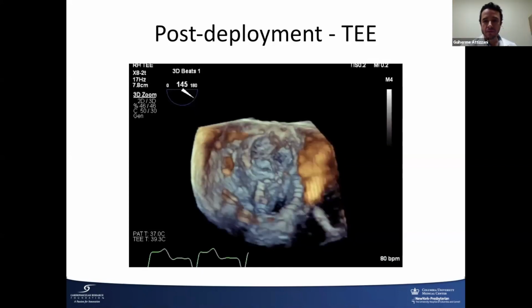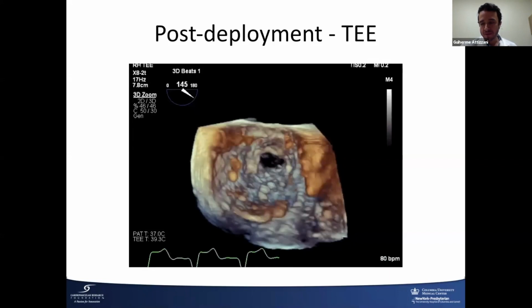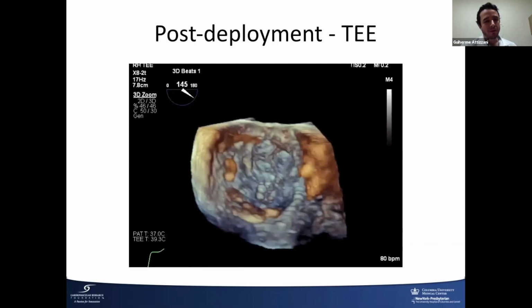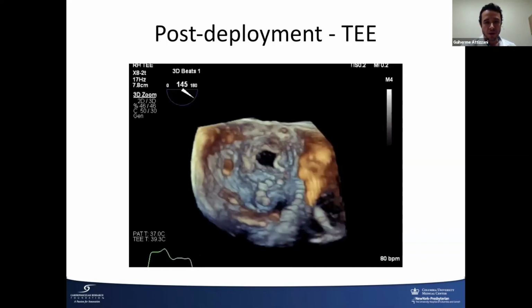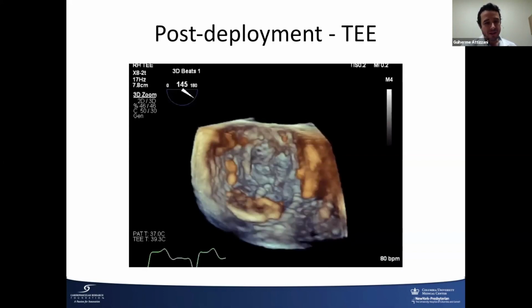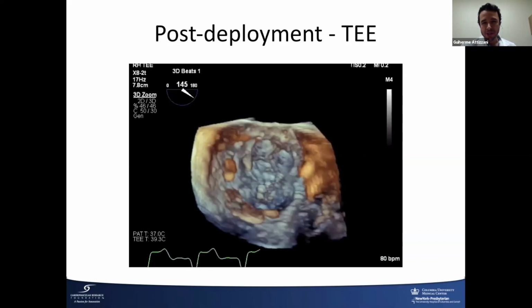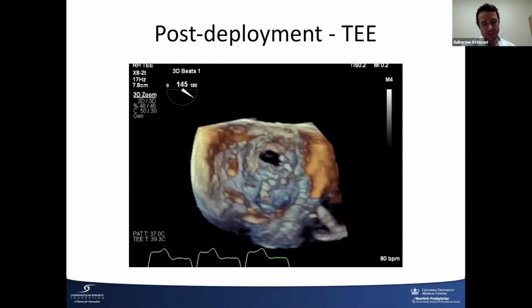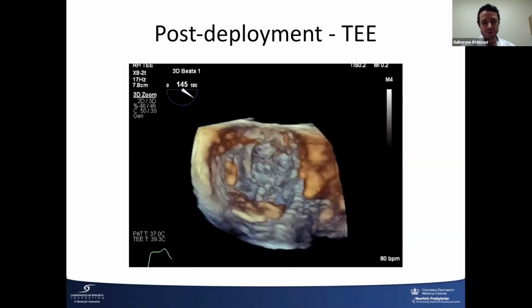Yeah, I think doing a pure AI case is just for really non-operable patients, for obvious reasons, right? But when this is the case, one thing that I consider significant is the amount of oversizing, the conversation we were having before. If we can do at least like 15% oversizing, then I would do the case very similarly to how I do aortic stenosis cases. I would pace the patient at a higher rate and always keep a forward tension in the wire, because the valves tend to dive down and not up. And I try to keep the shallow implant just like I do for my aortic stenosis case to maximize oversizing.